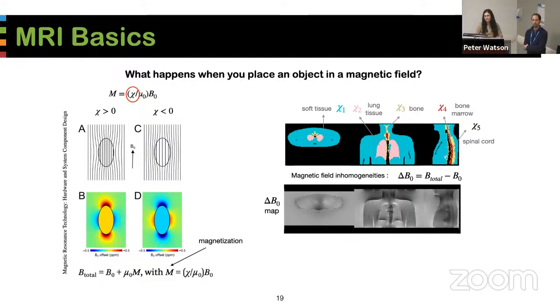So now I have a question. You showed the results of the comparison of the two shimming units. Those were measurements after shimming? Yep. Okay. So how was the process of getting the machine to machine, giving the approach? Which process? The process of measuring everything that you need to do the different shimming and feeding that back into the machine.